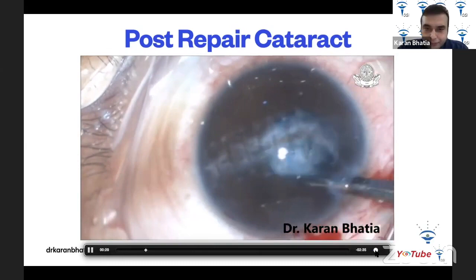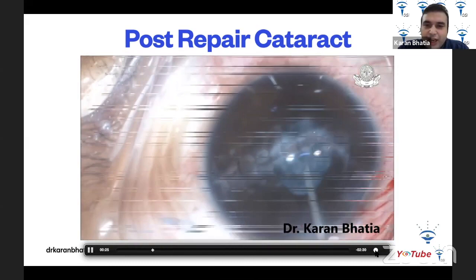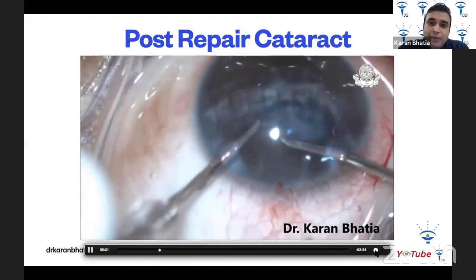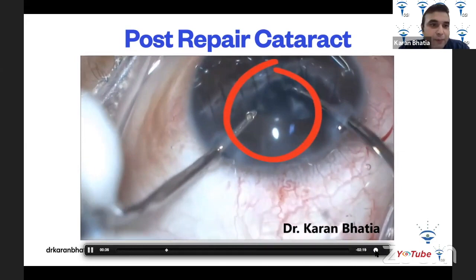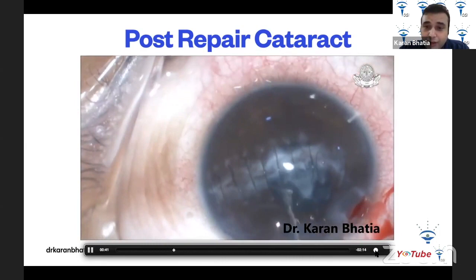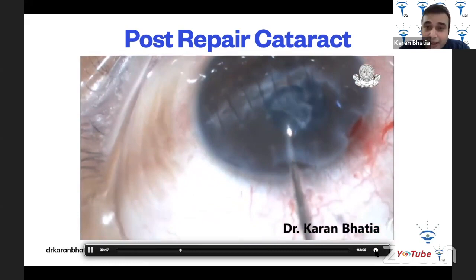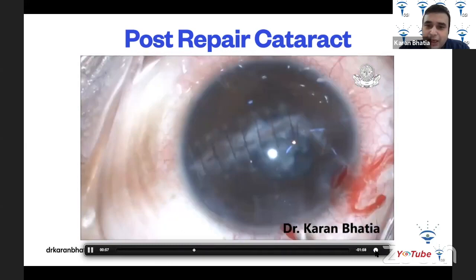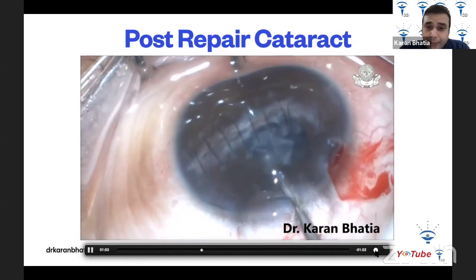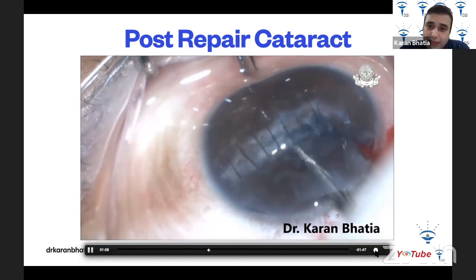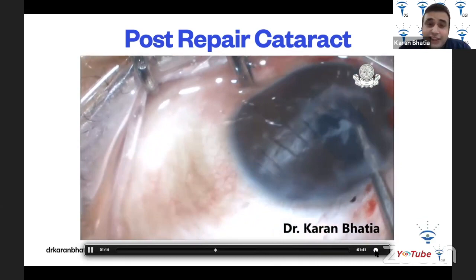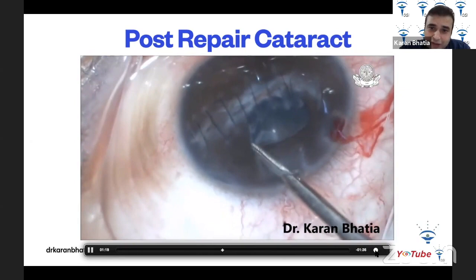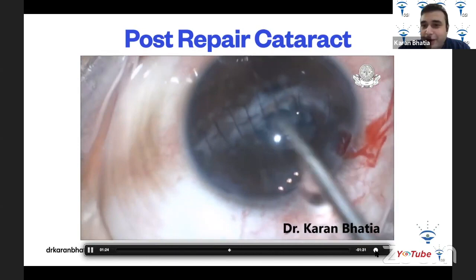In this next case, the capsule is taken out and cut with Vannas scissors. Bimanual IA is used to irrigate the cortex. A fibrous plaque is discovered — it is very important to remove this because it lies in the visual axis. OVD is injected underneath the plaque to create a plane, then micro scissors are used to give a cut. Rhexis forceps are used to peel it off — similar to performing a rhexis in cataract surgery. This is a tense maneuver as the posterior capsule can be easily damaged.